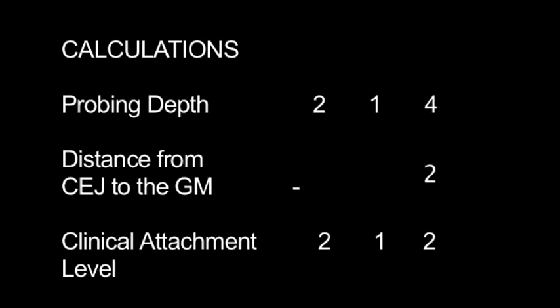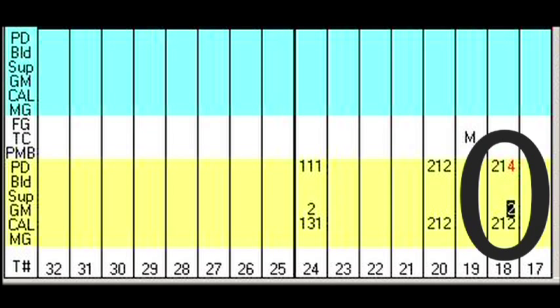is present. In Dentrix, the probing depth is recorded in the row labeled PD. The height of the gingival margin is recorded in the row labeled GM. If the patient has pseudopocketing, where the gingival margin is coronal to the CEJ, the measurement taken from the CEJ to the gingival margin gets recorded into the GM boxes.